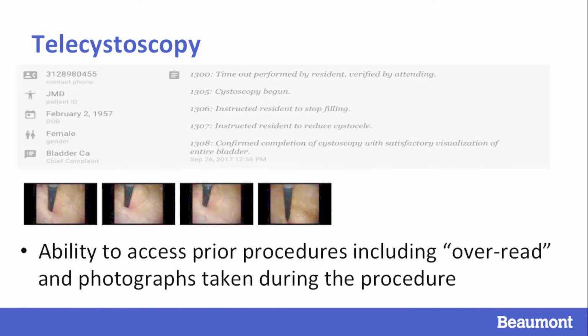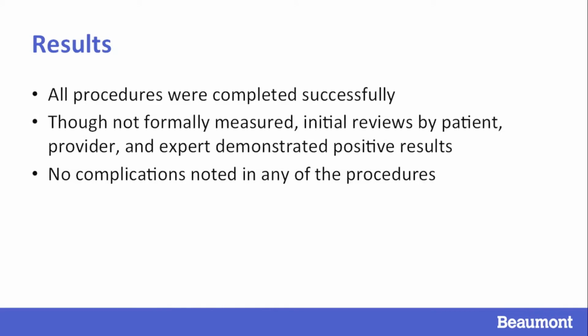This is a screenshot demonstrating the overread documentation for the encounter wherein the expert has the ability to take notes as well as photographs that can be accessed at any time through the encounter saved in the software. All procedures were completed remotely with no adverse events. Though not formally measured during this proof of concept study, initial reviews by patients, providers, and experts all indicated positive results in terms of satisfaction and comfort with the new technology.